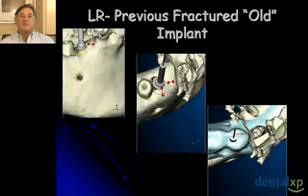plate. Now on the other side of this particular patient, you'll see in the upper left view as well as the middle view, on the left side of the screen, a little button. Well, that was a broken implant that was previously done by some other doctors in this patient's mouth.